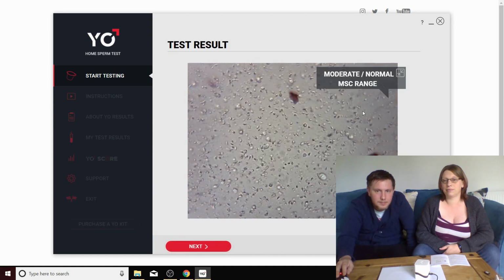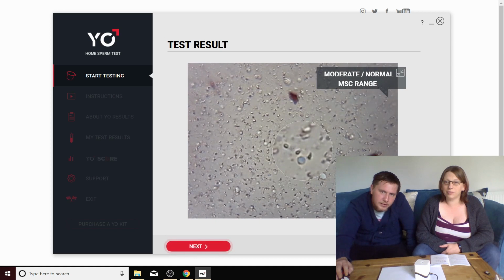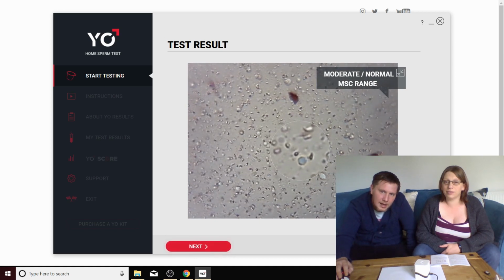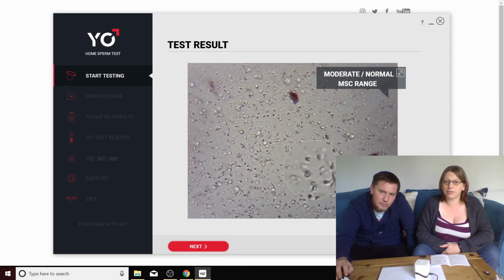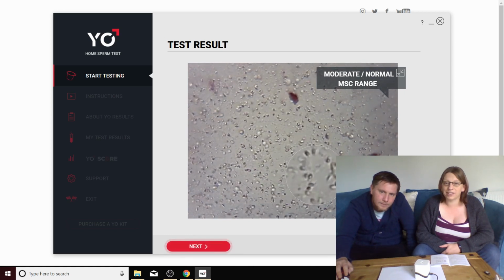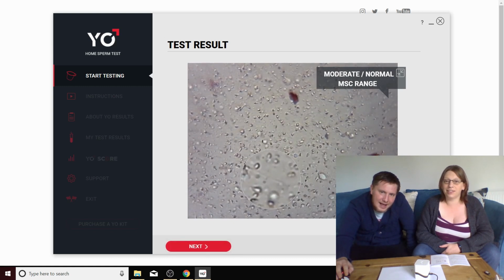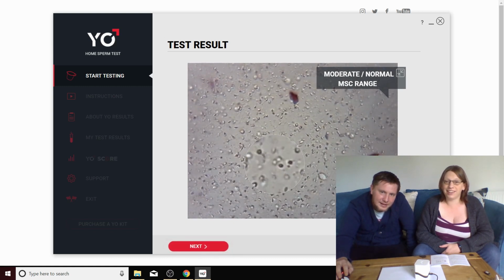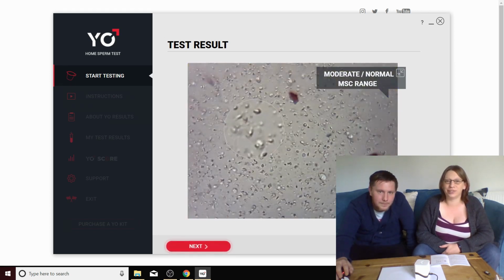So let's just minimise that. Have a good look, shall we? There you can see one moving around quite clearly, smack in the middle, with the head and the tail, which is really quite cool. Some very active ones going on down there somewhere. There are, yeah. This is fab, being able to see that. This one's going mad, isn't he? Definitely not in a straight line though. Cool. Yeah. I like that.